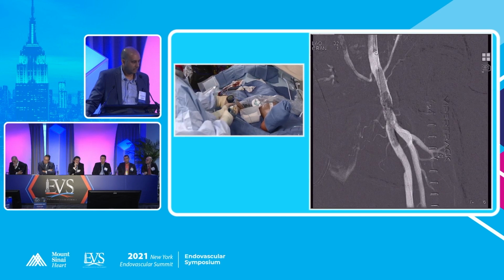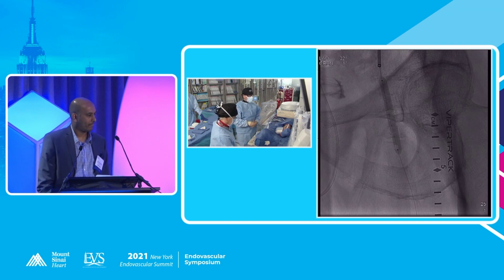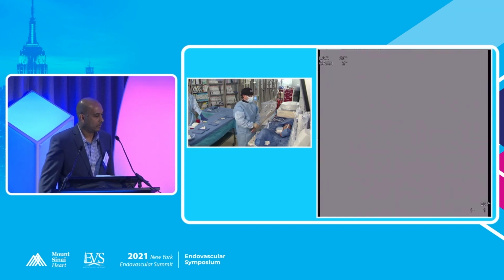Okay, 6. Sounds great. Let's go to our fluoro, please. Make sure they're seeing. Okay, there we go. So when we left, we did this Shockwave 7 balloon. You can see it expanded very well. All right. So after that, I want to show you the angiogram.